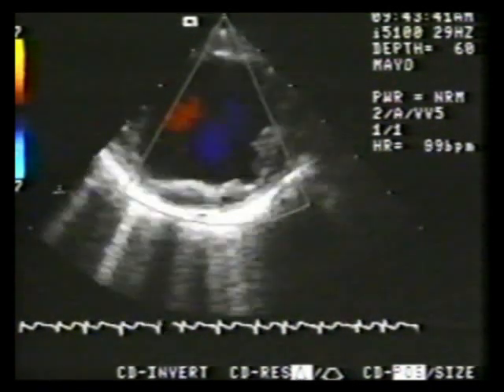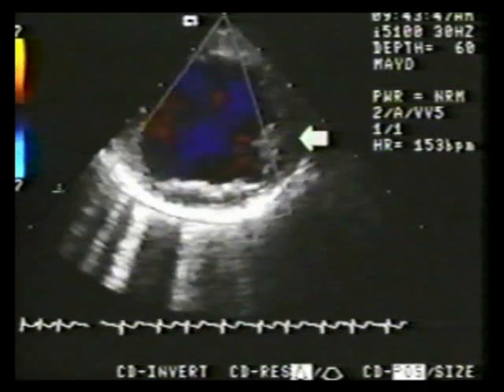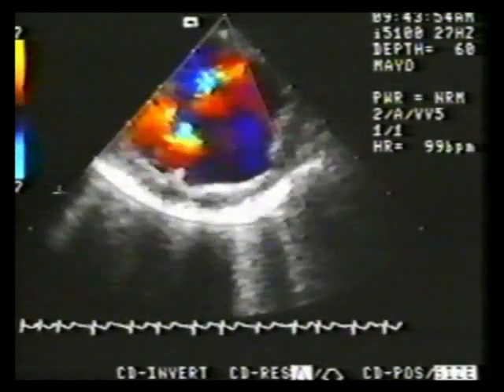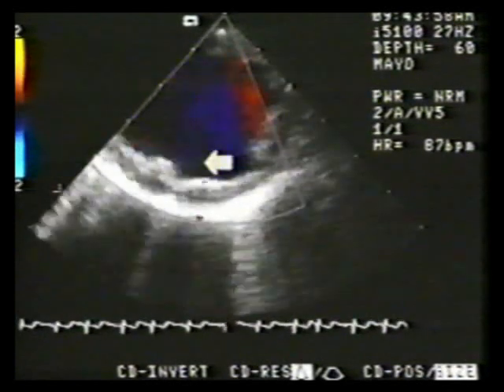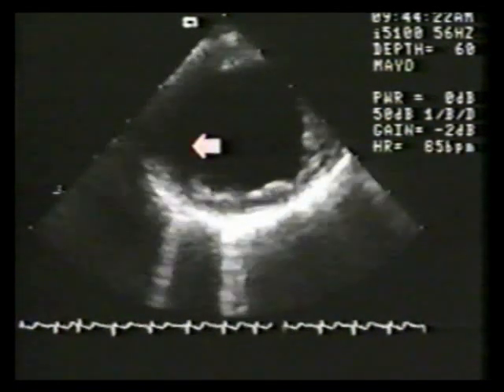Aortic ulcerations can be recognized by the transesophageal echocardiogram. More importantly, as the scan is taken toward the aortic arch in this particular patient, small endothelial excrescences or pedunculated masses will be visualized. Endothelial irregularities should be considered a potential source of embolism.